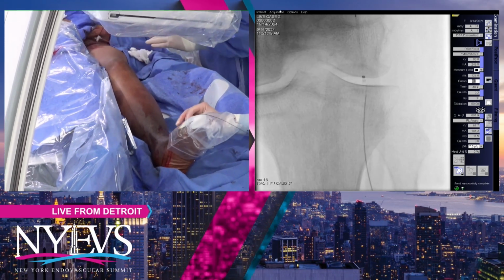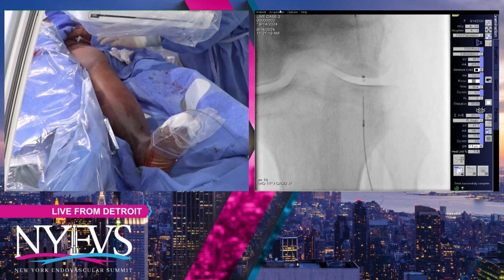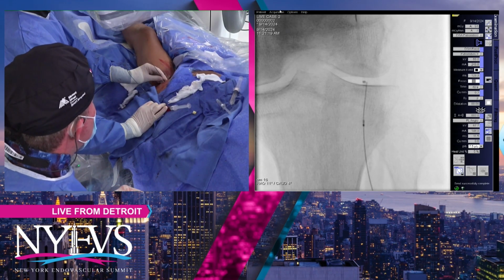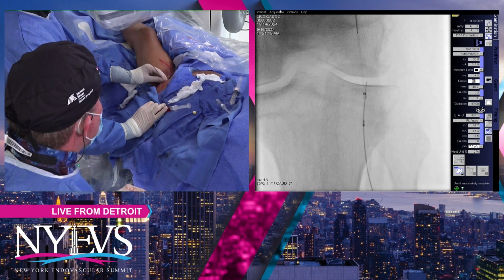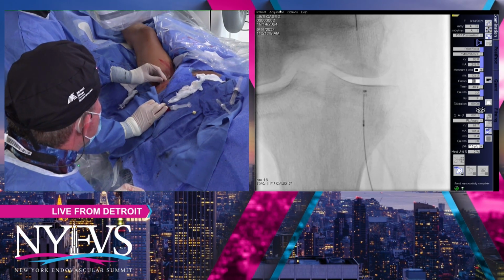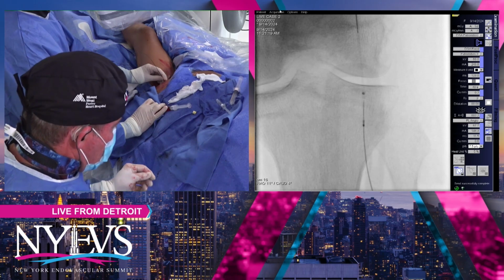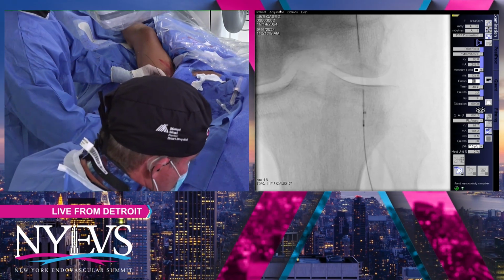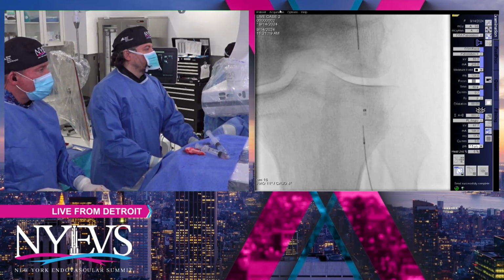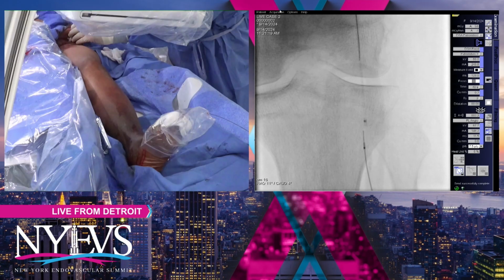Like in the last case where Miguel kind of stopped and didn't push forward because he didn't want to dissect, I probably wouldn't have done that. I would have tried from above. But what I have moved to now is I don't spend nearly as much time coming from above as I used to, because once you start struggling from above, if it's not going easily and smoothly, if you feel like you're in deep subintimal planes, it's almost always better to just abort that and go from below.